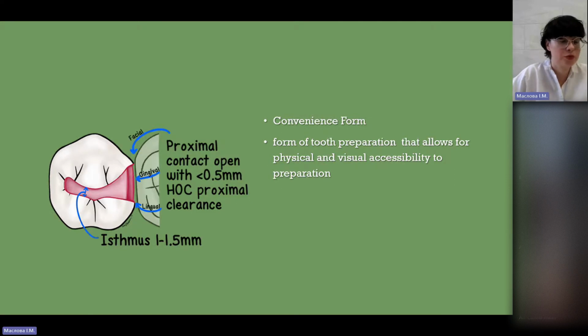Use the probe to check for appropriate dimensions. Incisogingival length is 2 or 2.5 millimeters, no greater than 3 millimeters, depending on the length of the contact. Gingival floor width: I show you this gingival floor or gingival wall. The gingival wall width is from 1 to 1.25 millimeters.